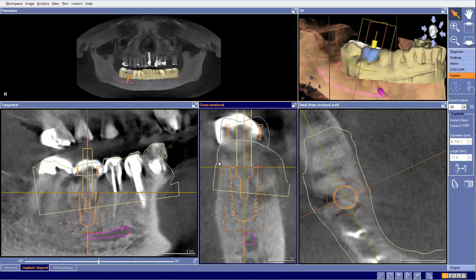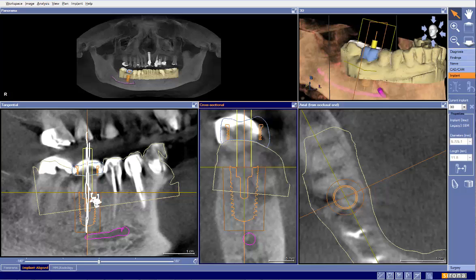In these soft bone situations, especially in a case like this where we have infection, even though you drill your osteotomy correctly, when you go to hand place this implant it's going to have a tendency to go to the path of least resistance and create its own new path. This is why I'm a big fan of using true guided surgery, where there's a mount that fits into the sleeve that will control the trajectory of the implant as well.